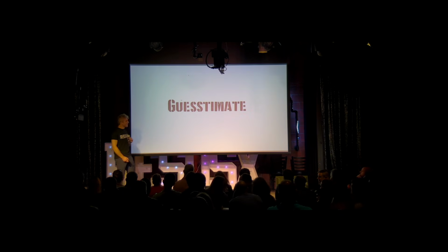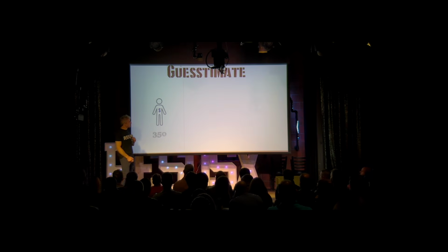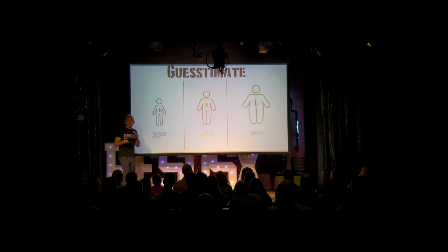One or two, right? So most of us do something like this, right? We guesstimate. We kind of look at the patient. If they're small, we say about 350. If they're medium, 420. And if they're big, 500, right? And I'm going to tell you, they're probably both equivalent. When you look at data on 6 cc's predicting the actual lung volumes, it's really bad. It doesn't work very well.